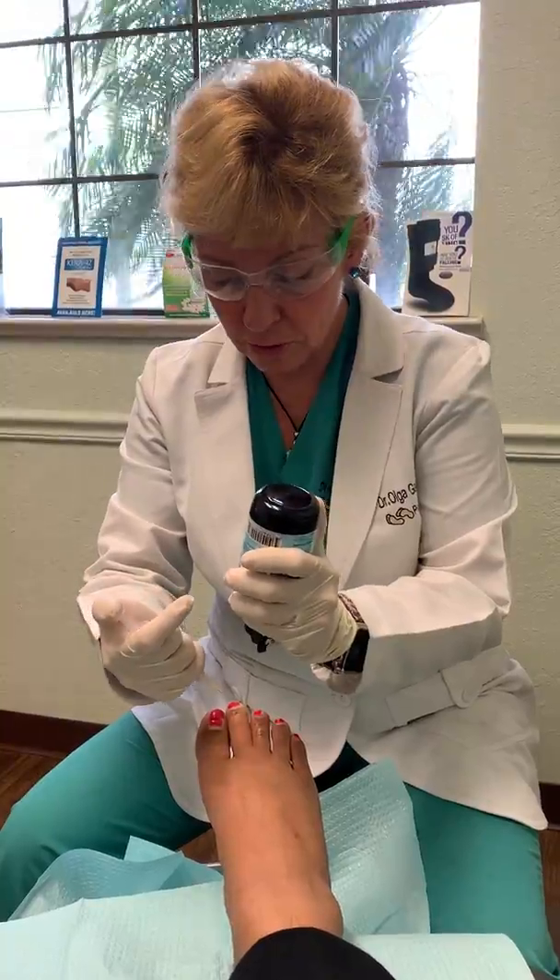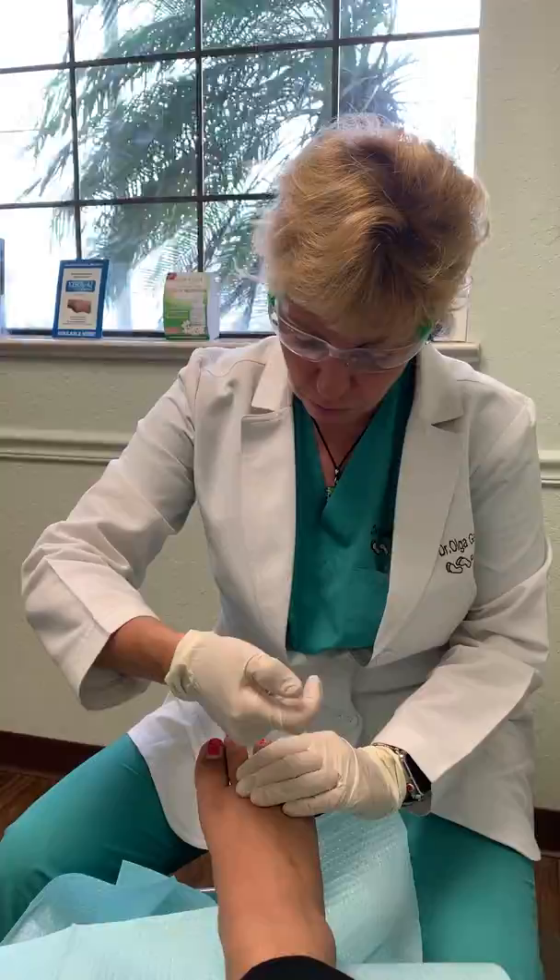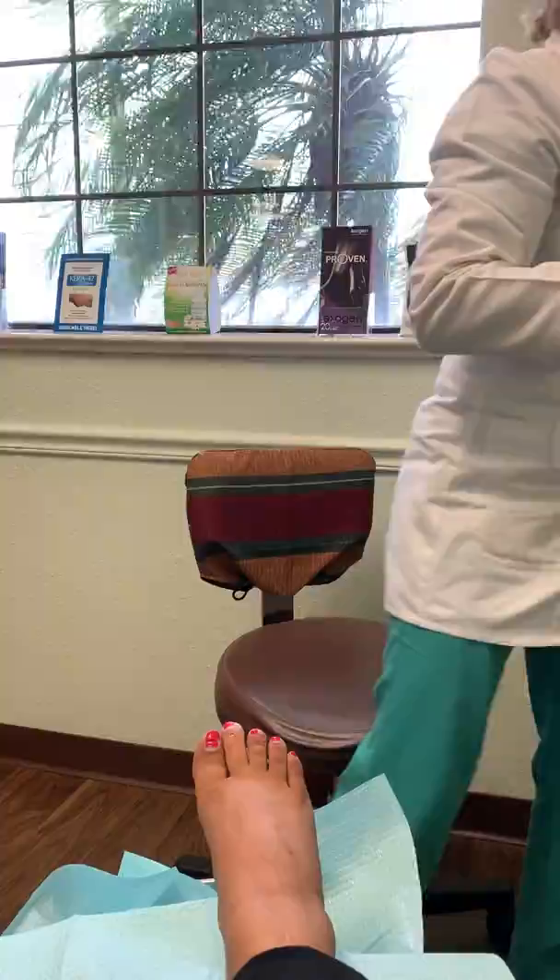What I'm going to do is finish up numbing it. I'm going to use a little bit of ethyl chloride spray and just a little bit of lidocaine. We already numbed it up a little bit so we're just finishing up right now. You're going to feel pressure, not pain — not a sharp pain — but it is normal to feel a little bit of pressure.